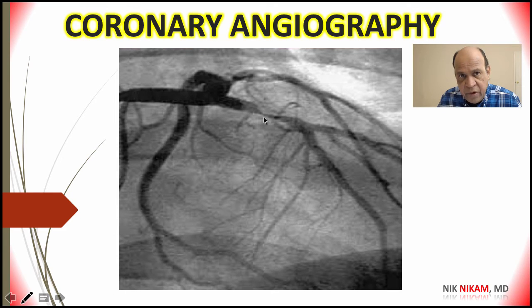So this is an important lesion because this can lead to extensive anteroseptal myocardial infarction, and since there is still perfusion, this is the time to do coronary intervention and open up the artery. So hopefully we can prevent any major further cardiac event such as acute myocardial infarction.